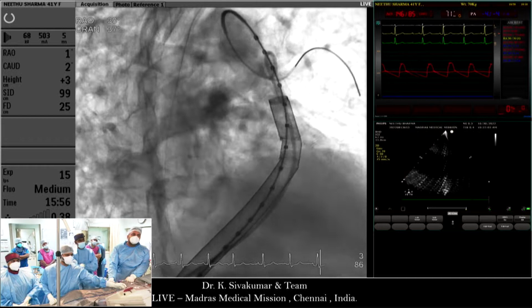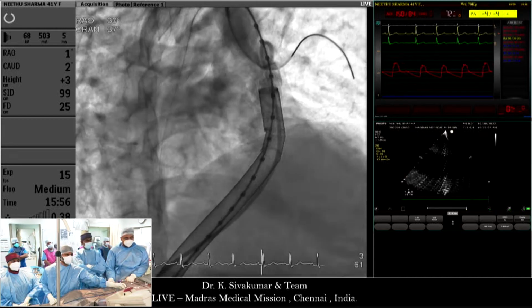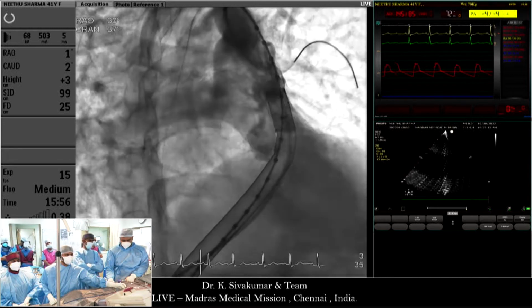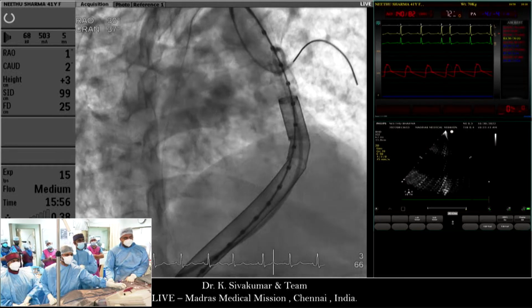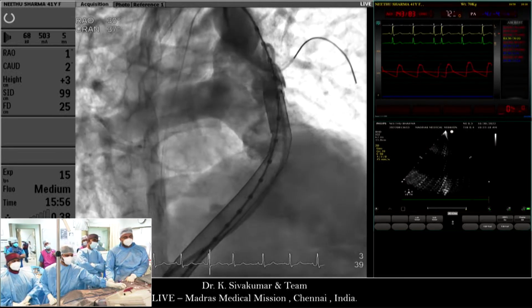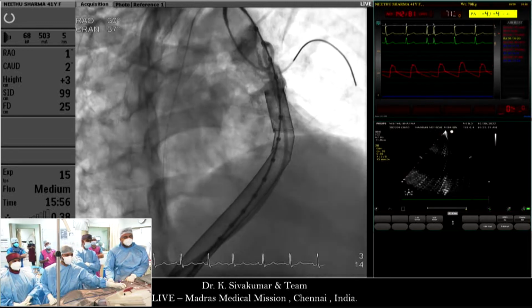So this is an angiogram with the Lundrequist in position, with the sheath in position, in RAO projection, which shows the separation of the LPA and RPA, quite pulsatile RPA and LPA, and a sort of uniformly tubular outflow tract. I'll show a couple more angios.